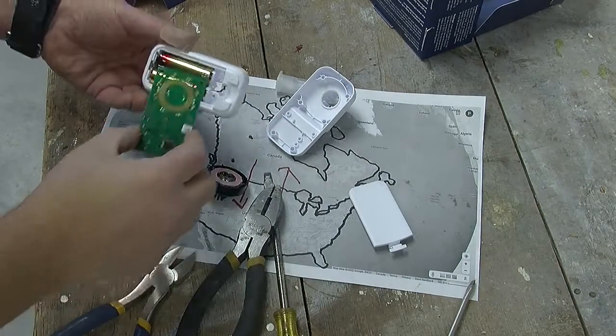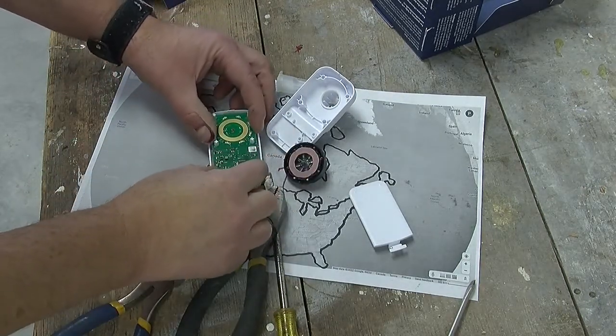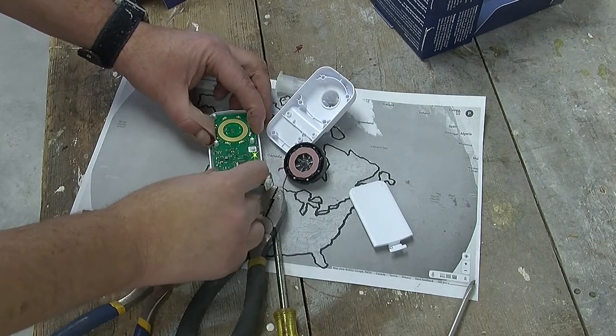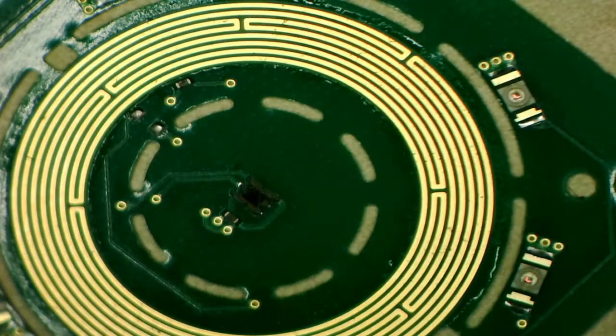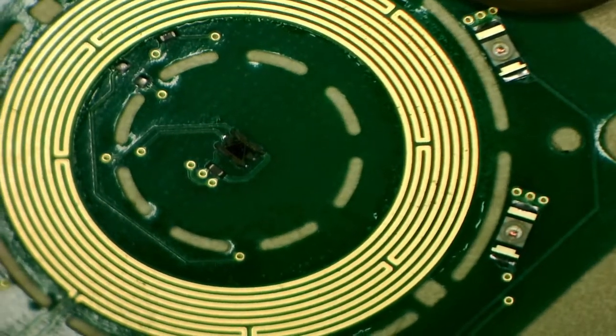I figured it'd be kind of fun to see if it still works after we take it apart. And yeah, the things light up. So let's go look at the microscope and see if we can figure out what these parts might be.